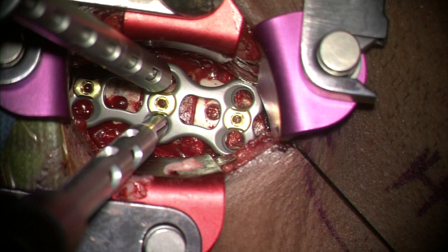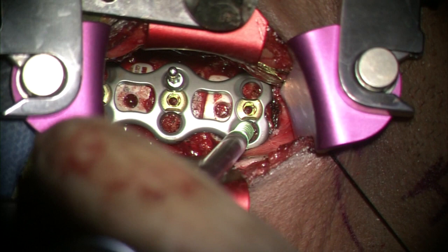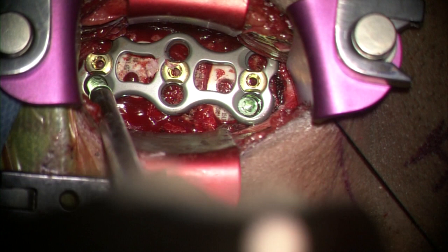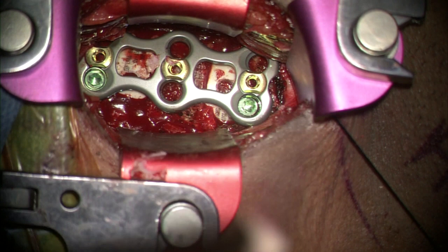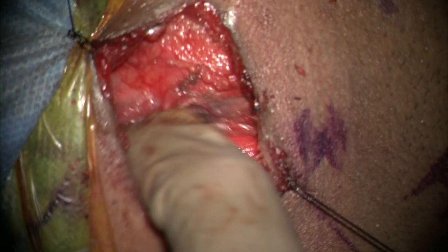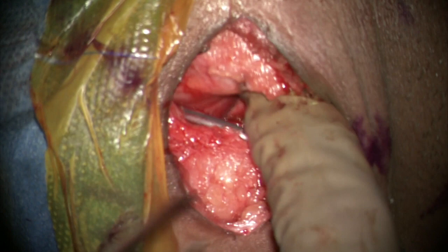A cage or graft of the same size as the sizer is then gently hammered into place. The size of the plate is such that the upper and lower screw holes are just above and below their respective endplates, to prevent adjacent segment disease. The required screws are placed into the plate and ultimately locked onto the plate. Following a thorough wash, the viscera is inspected and a drain is placed into the prevertebral space.